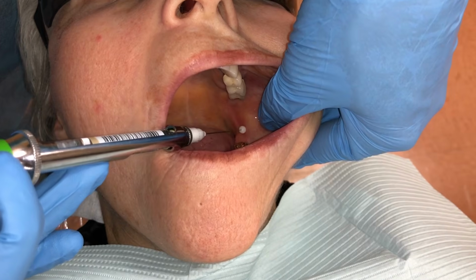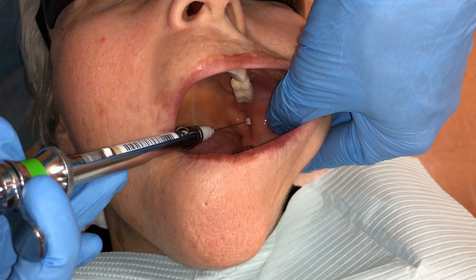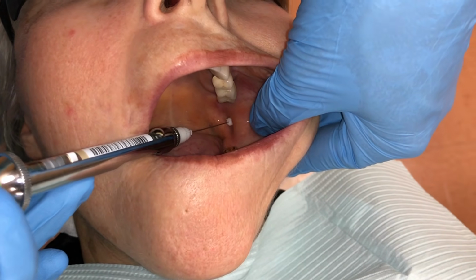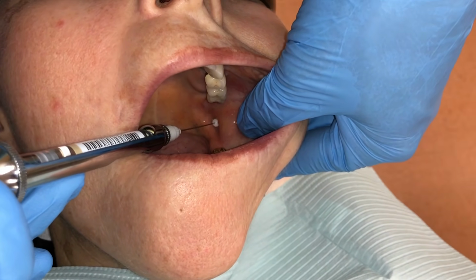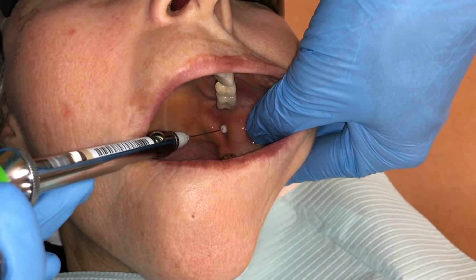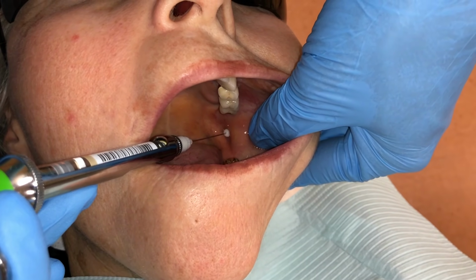If premature contact occurs, the clinician can withdraw the needle slightly and reinsert. The position for the lingual nerve block will be the same as the IA, with a difference in depth and dose.